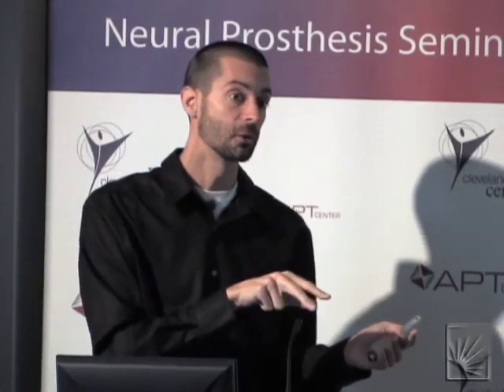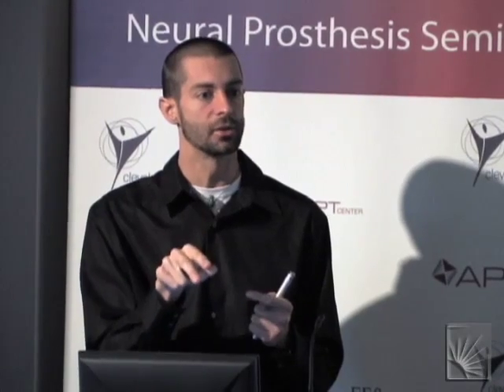One of the problems with using multi-contact stimulation with the Medtronic device is that it just has a single stimulation channel. If you use multiple contacts, they're voltage-controlled devices, so you can only have one set stimulus amplitude. If the electrode-tissue impedance is different at the two contacts, you're going to get different current flow out of those two contacts, but you don't know what it is because you don't know how the impedance is changing at those contacts.